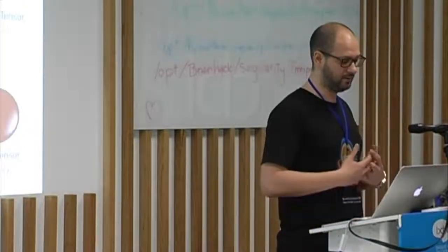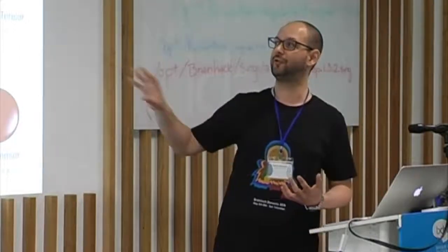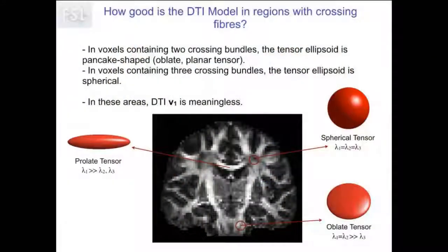So how can we put those three different shapes into the context of a brain? We take another cross-section, one of the same cross-sections that I showed you before, and look at three different areas. Taking the simple one, the body of the corpus callosum, there is a very good fit, a very good prediction of our tensor shape: a cigar shape right here, very clear anisotropic behavior.